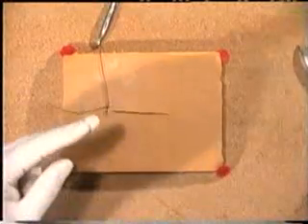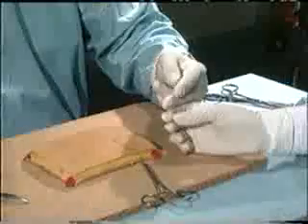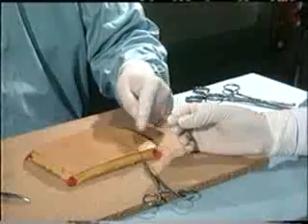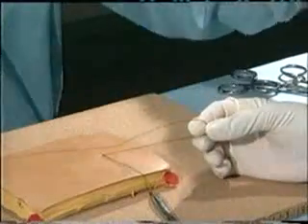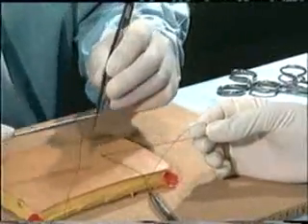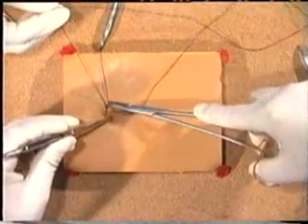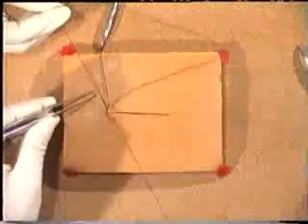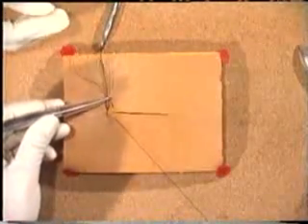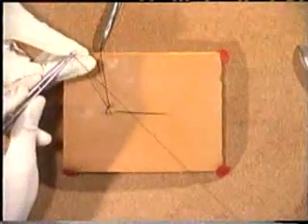Then pass the other length of the suture to your assistant and make sure that they hold it the right distance from the wound. Not too close and not too far away. Then continue suturing. As you insert the suture and pull it through gently, your assistant should release the suture and allow you to snug it down. Pass it again to the assistant.